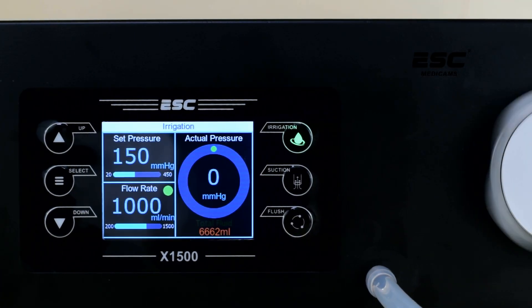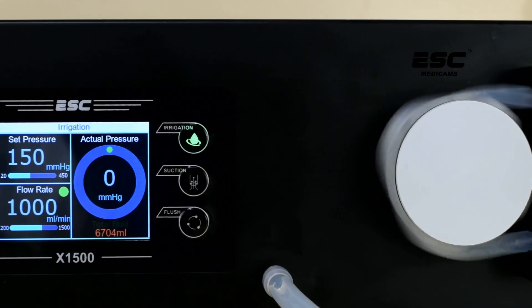ESC Medicam Suction and Irrigation Pump. Experience the smarter way of fluid management.